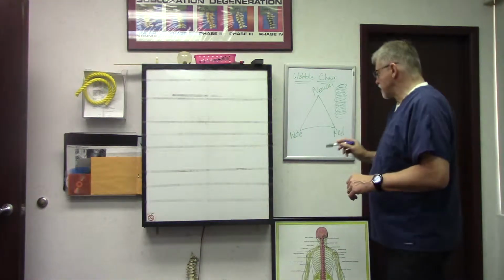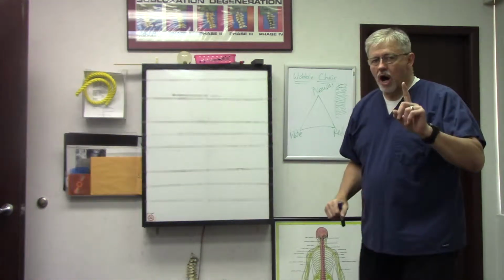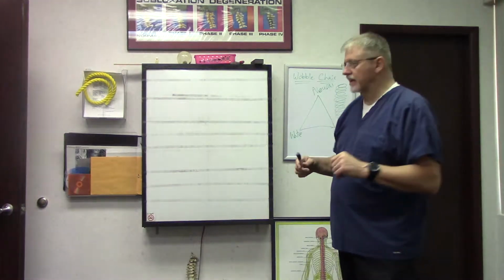They're using the brain, and they're using the voluntary nervous system, which we call the pyramidal nervous system, and we're using the voluntary muscles, which are more surface. They are not the primary stabilizers within the system. And so we are working with the type 1 slow twitch postural muscle fibers, and so we're going to be changing those. We'll talk more on that later.